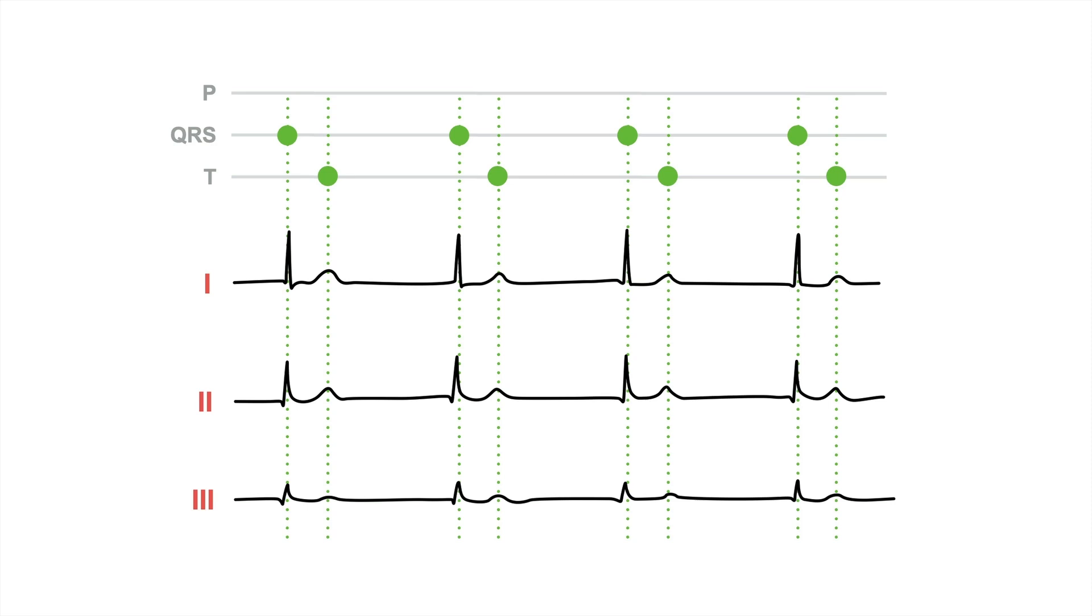But where are the P waves? Well, to be honest, there are none on this tracing. But you might believe me that they're actually hidden within the QRS complex.